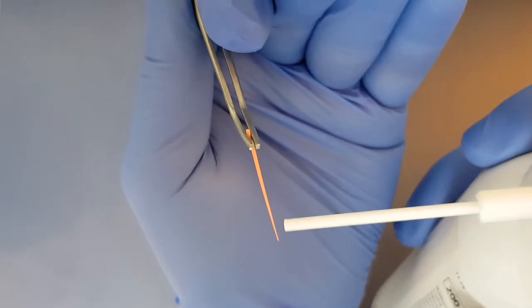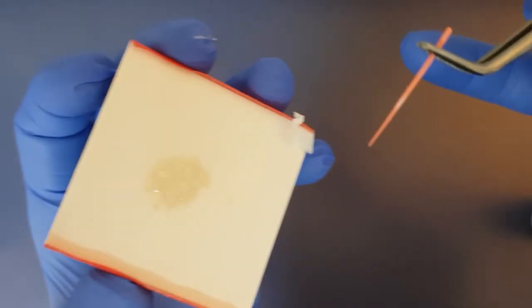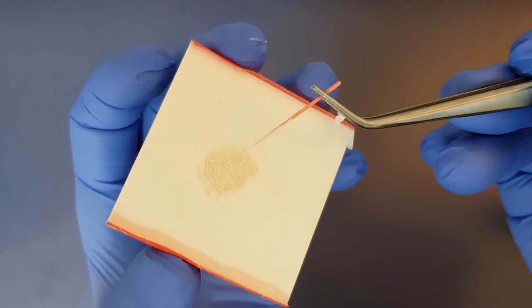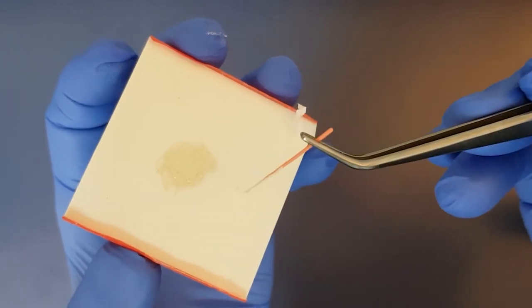So to make the accessory points tougher and more sturdy, ask your nurse to spray it with endofrost or pharmaethyl and then put a thin coating of sealer at the tip. The endofrost makes it freezing cold and when you put the sealer on it gets stiff, so you can easily slide it down the canal without it crimping up. When I started doing this I found it so much easier to get the points all the way down the canal and I could fit way more in.